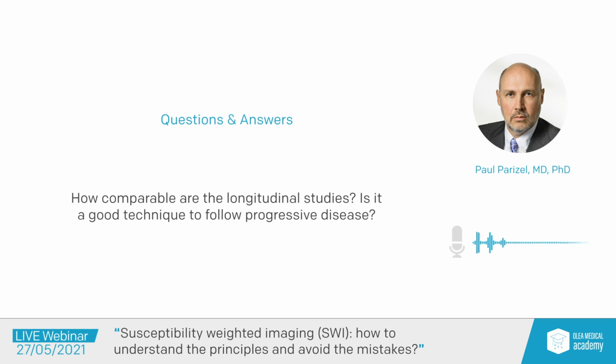More and more we see that a lot of the stuff that we do in follow-up of brain tumors, in follow-up of patients with dementia, with traumatic brain injury, we are shifting towards longitudinal follow-up studies. And in that, eyeballing a lesion is not enough. You have to have quantitative information. You could do that with various types of artificial intelligence, but I think that is where the future is going.